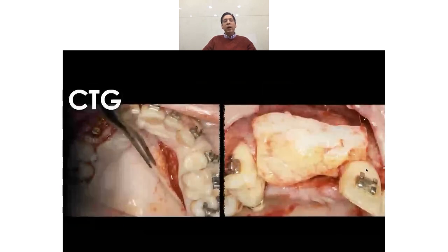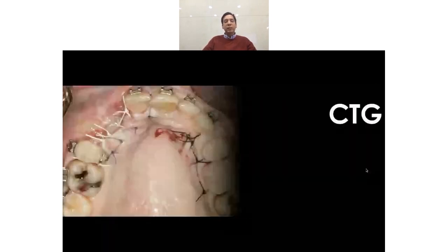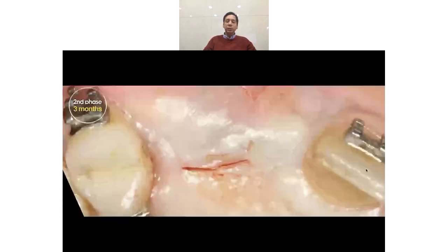And then we harvested a CTG from the other side of the palate. We fixed the graft like a saddle, and then we submerged both the implant and the flap and the CTG, excuse me. So here we can see 3 months later the aspect. The ridge is totally rebuilt. And now we're going for the second surgical phase.